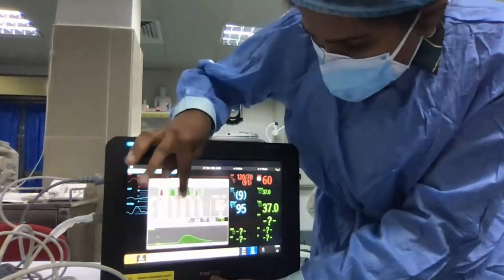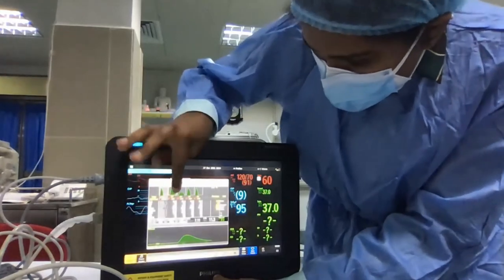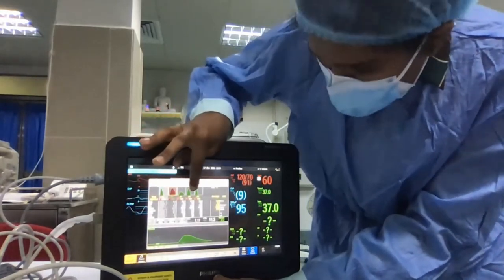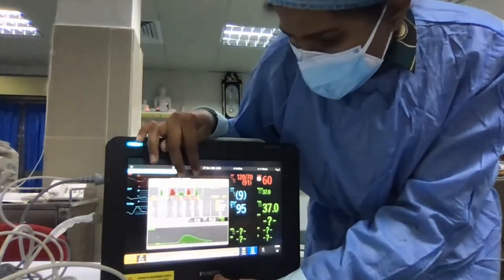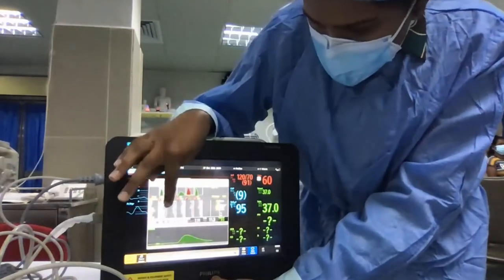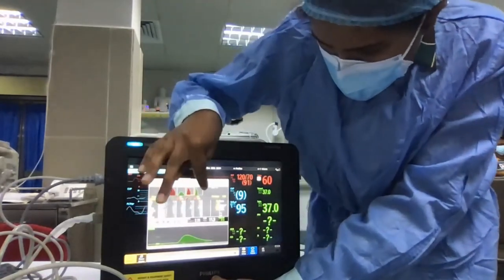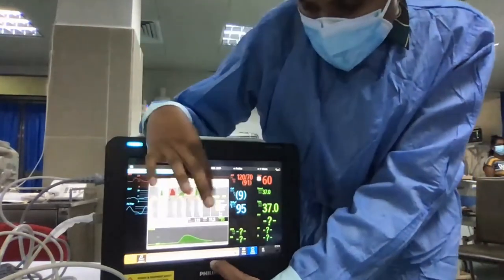Okay. Then I will reject this one as well. Not this one, I will keep it. Then this one reject. This also reject. I will reject these two because they are a little bit lower than 11 point something. So I will take into calibration 11.4, 11.4 and 11.3. These three.